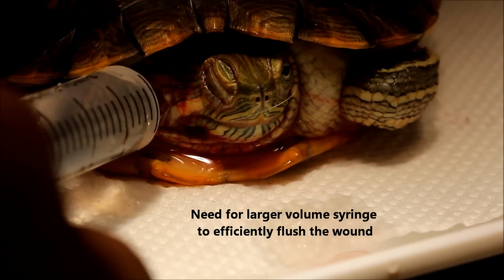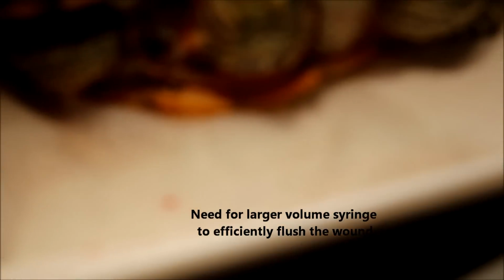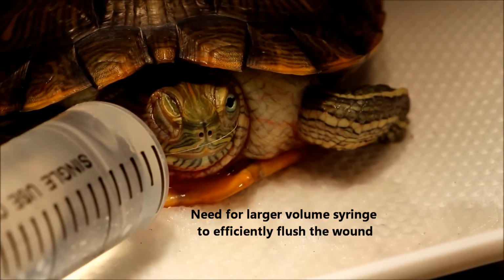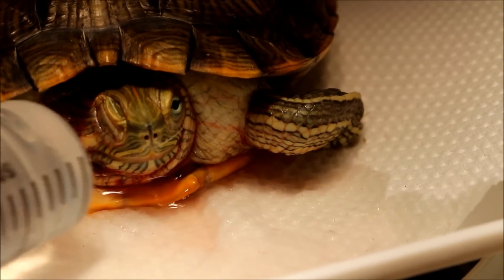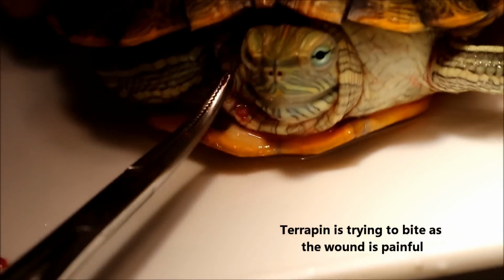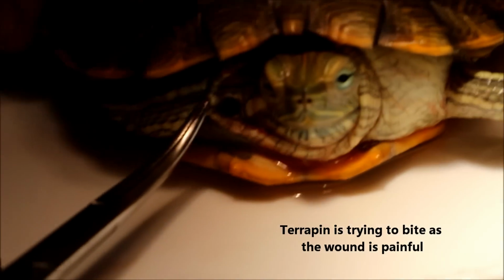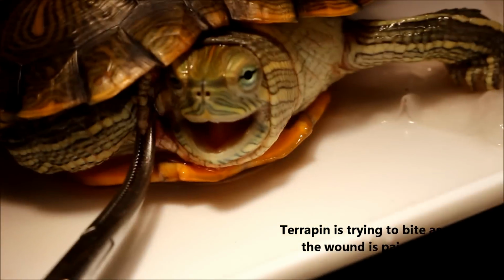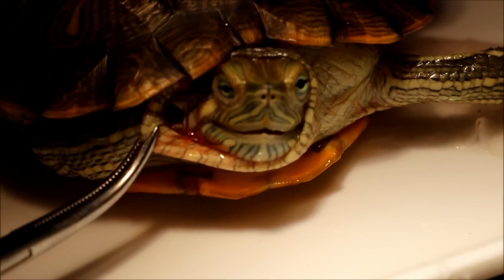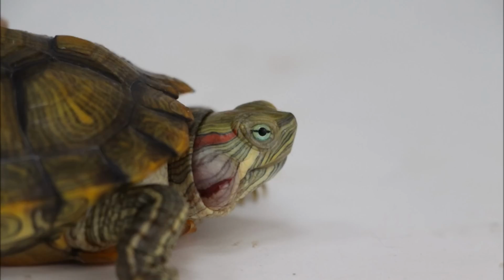There's a hole. Shoot some more. That's why you need a 20cc. Because if you only got 5cc or 2cc, it take a long time. The hole there. Where's the hole? Show the hole is there. Clean already. Show the light. Turn to the light. Cool. Okay, very clean. So we close already. Okay, bring.